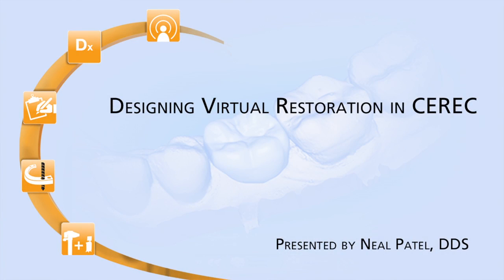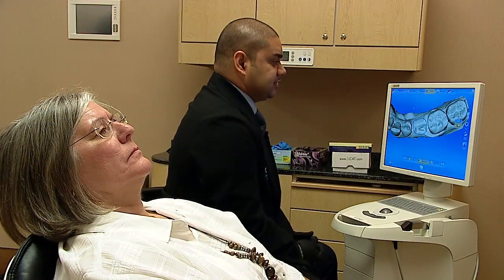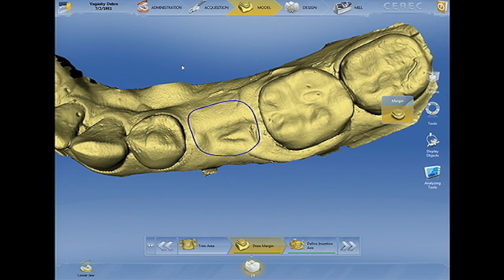Considering that this is a virtual restoration, we don't necessarily have to take the time and put in the energy to make this restoration look perfect. The objective is to identify a tooth that has the appropriate dimensions for the space where we're planning an implant, both at the occlusal plane, but within the arch form. And most importantly, in my opinion, is to develop a tooth that has the appropriate emergence profile.